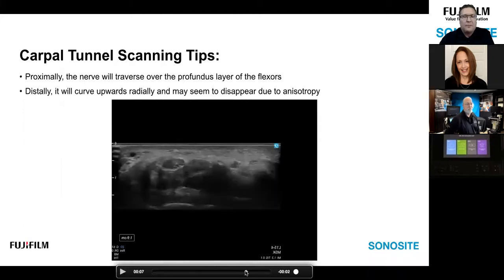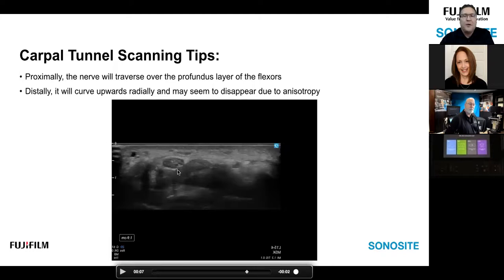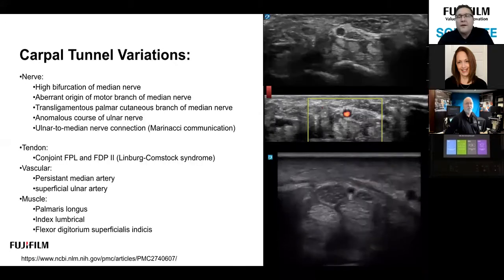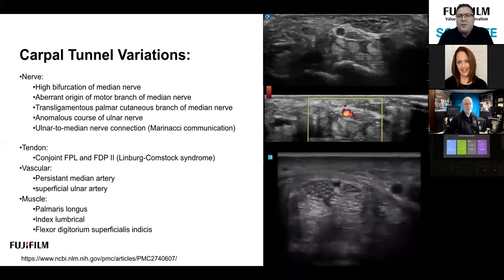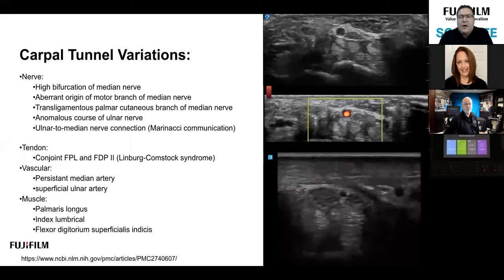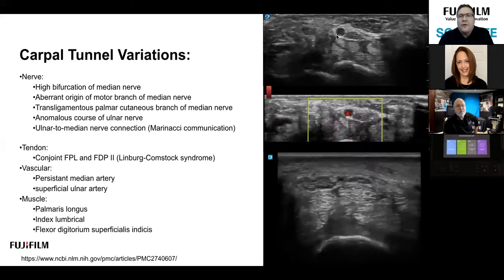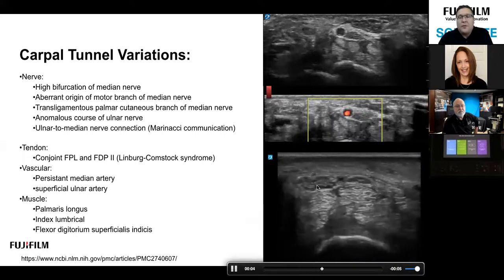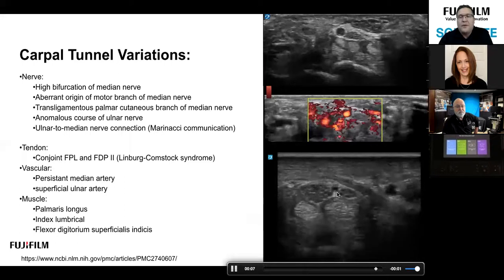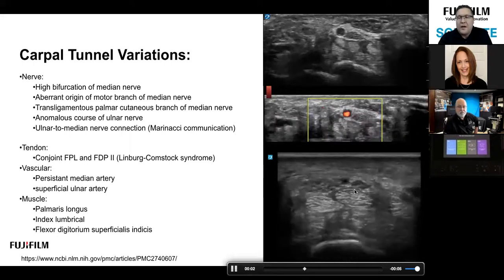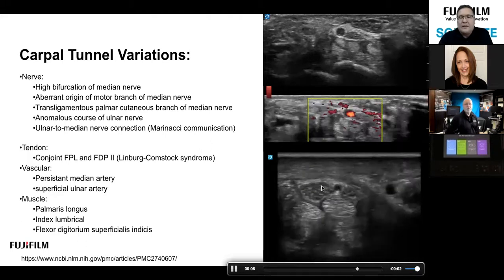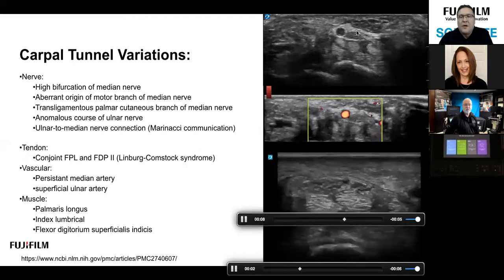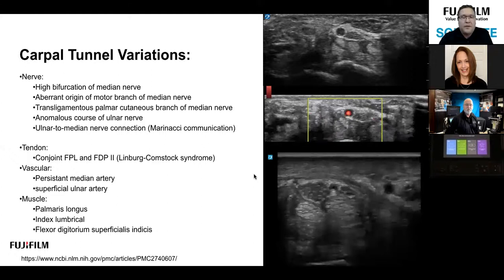In the carpal tunnel, the median nerve is much less impressive in brightness. You'll really be working on your angulation to get the fatty epineurium and the fascicle walls to echo back — because the fascicles themselves are dark. Other things to consider: a bifid median nerve and a persistent median artery — always throw on your color Doppler. Here at 19 megahertz we have a video clip showing both segments of the bifid median nerve with the persistent median artery right underneath, showing the intrafascicular detail we get at 19 MHz versus 15.